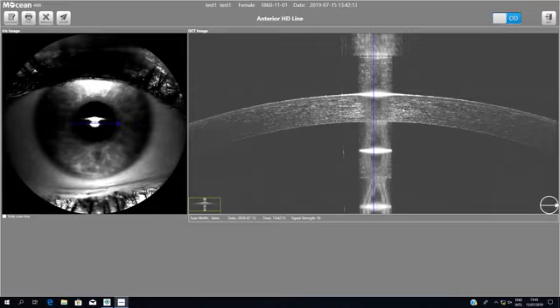It is very useful if you want to see a patient after a LASIK, for example, or if you want to see a patient with opacities, you can locate the depth of the opacities. You can use that in cases of a patient with a transplantation, or even if you want to fit contact lenses. By using this HD line, the OCT will allow you to have all the information you need in order to have all the details you want to proceed with your patient.